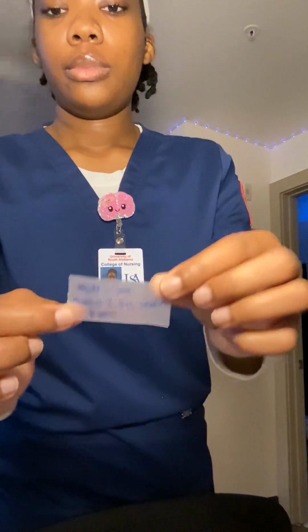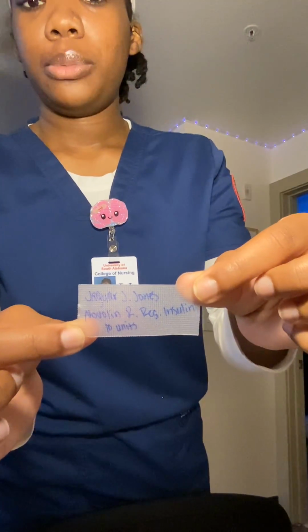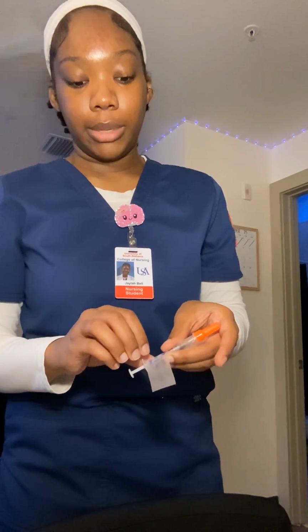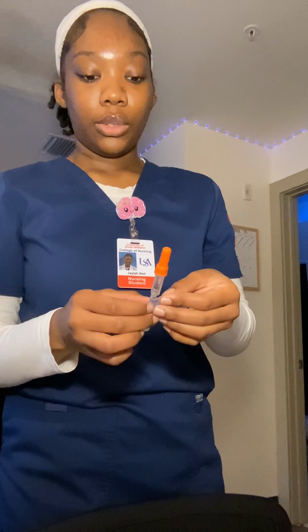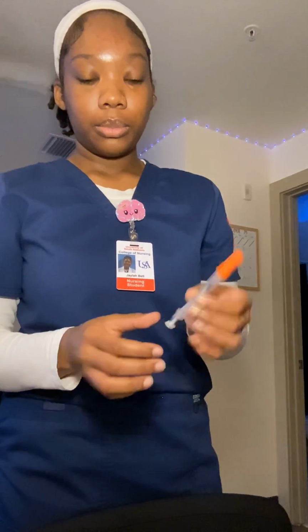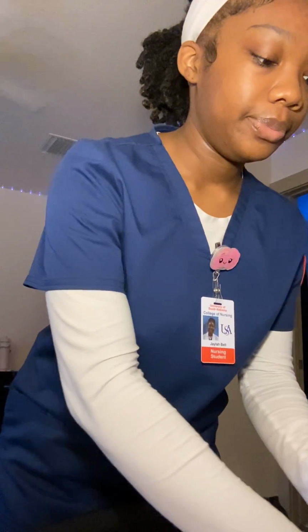I'm just going to show y'all my label so y'all can see. Okay. I'm just going to take this piece of tape and just wrap it around my syringe so I can know exactly what is in here. Alrighty. Now we are ready to move into the patient's room. So I'm just going to move everything to the side so y'all can see everything.